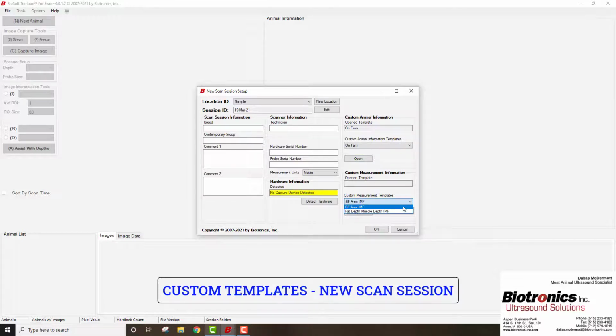When we go to back fat, let's say we want to do this one, and then we open that one, it opens that up. At that point this template and this template are going to be available for this scan session, and it will be consistently there for you every time you open that scan session. The last time you open these is going to come here, but you're going to have to open them up each time you do that.